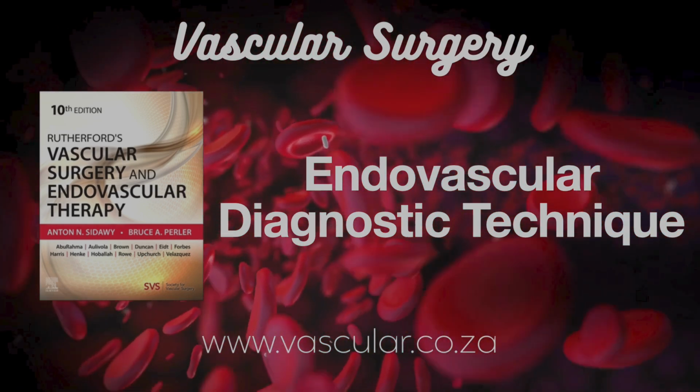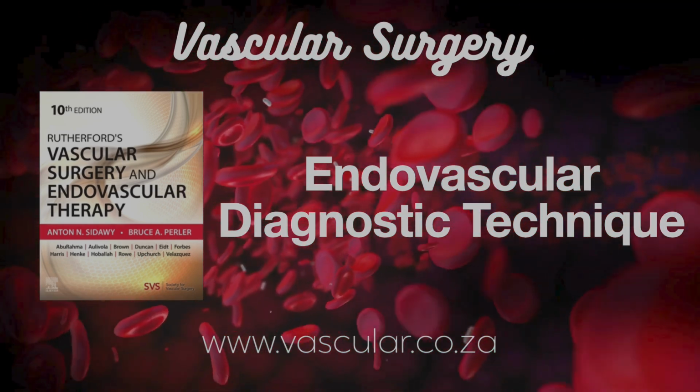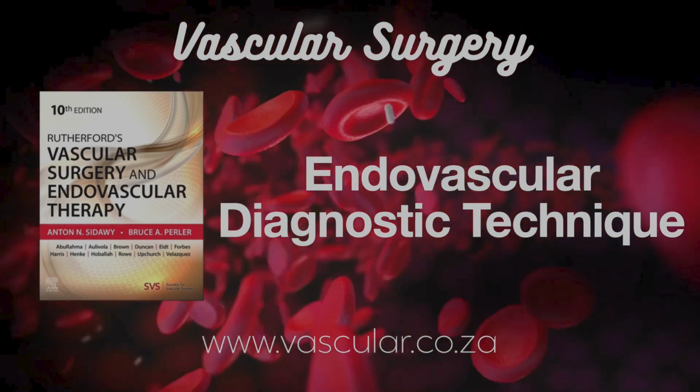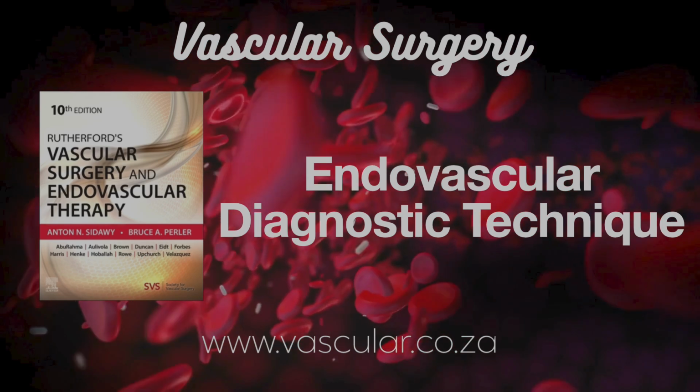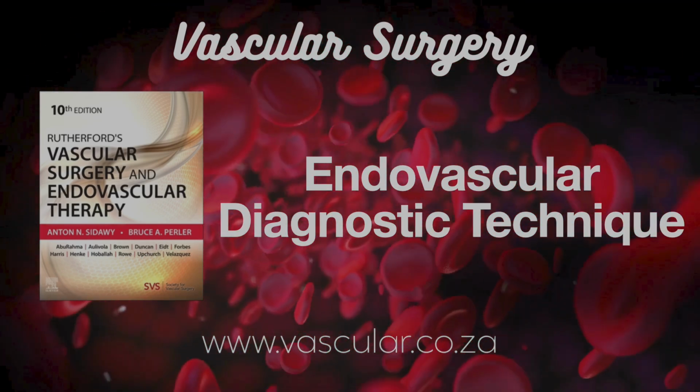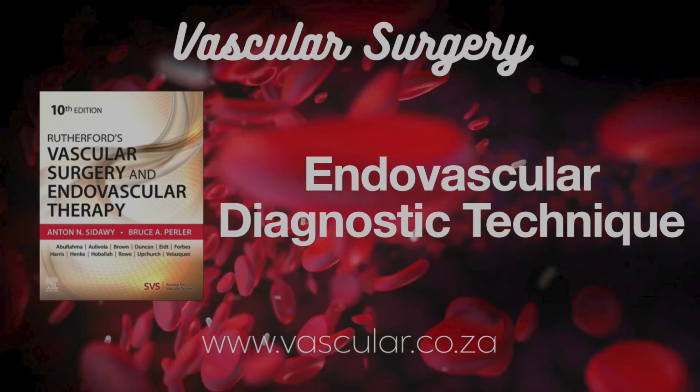Which foot arteries are best? The dorsalis pedis on top of the foot is great. Superficial, easy to compress. The posterior tibial behind the inner ankle bone is another good one. Palpable, compressible. And the peroneal? Rarely used for access. It's just too deep between the bones, hard to get to safely percutaneously.